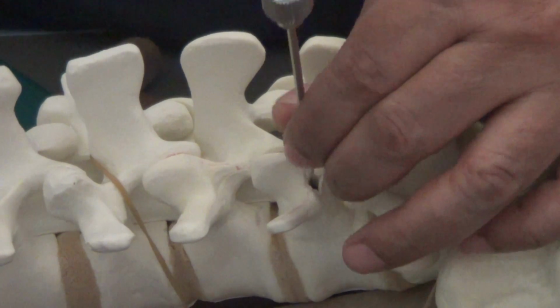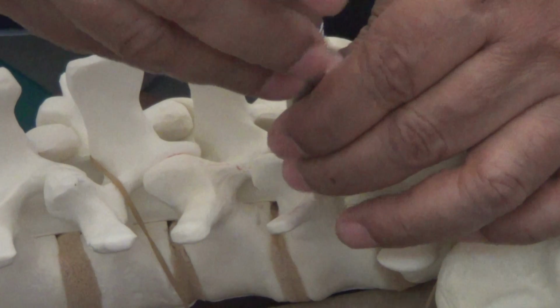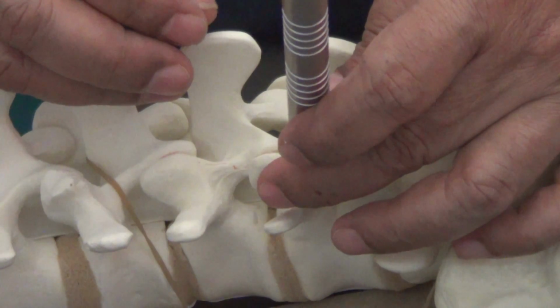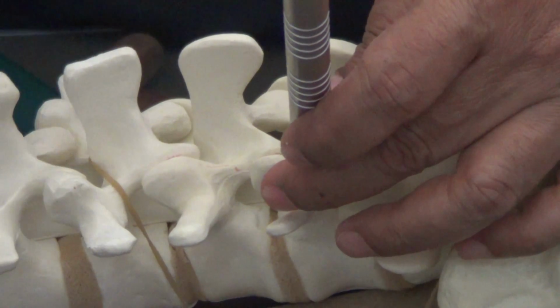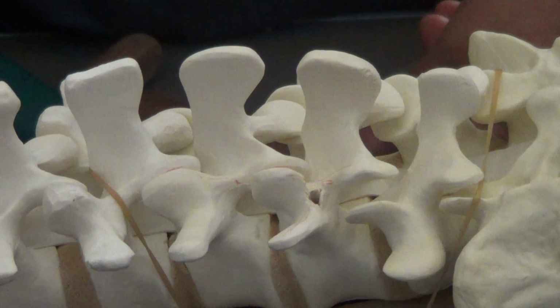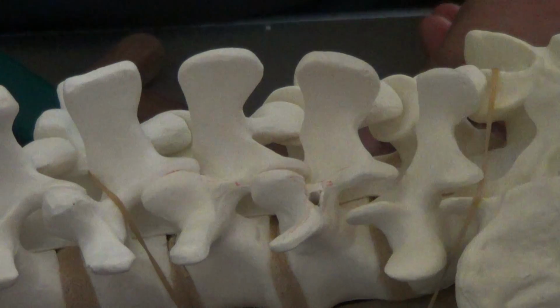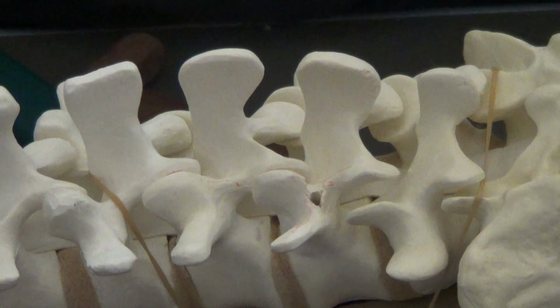And then you again feel for it, and sometimes you can feel the anterior border, and then you measure out the length of the screw, 40, right? So once you measure out the length of the screw, which is 40, then you select your screw. The size of the screw that you see is 640. Right, 6 millimeter, it's okay.